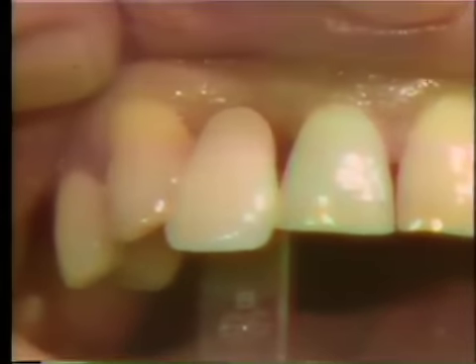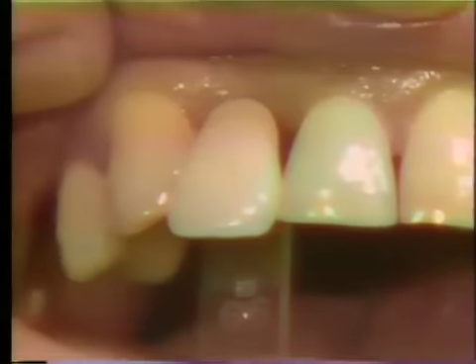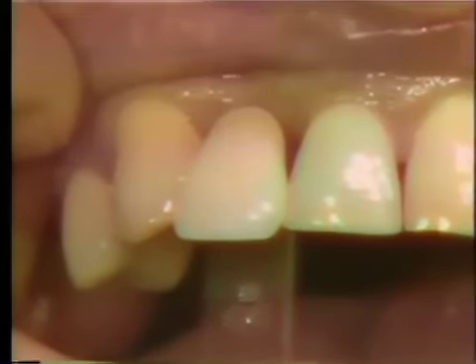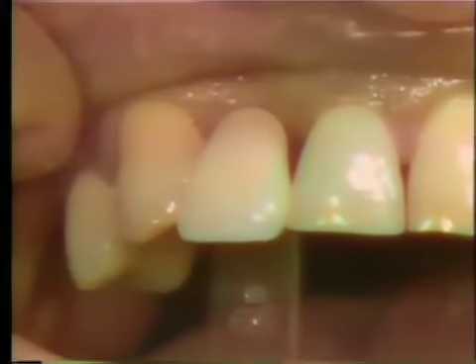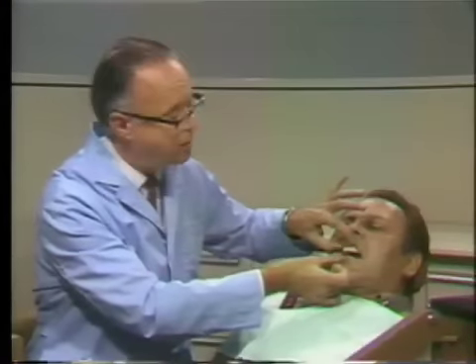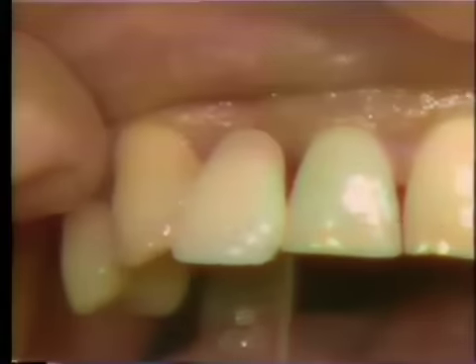One has to remember that it may or can be darkened up a little in the cementation process when the Pontic facing is fixed onto the backing. So we allow for that a little bit in the selection of shade at this time. And this shade 66 should be quite a good selection for this particular patient. Anywhere else other than a TV studio, we would perhaps change the lighting a little bit and see how it looked under daylight and so on, just to make a final check. But I think we can be fairly sure that this one will be within the range of adaptation during cementation procedures. So we'll make a note in the record to use shade 66. And that completes this particular part of the operation.